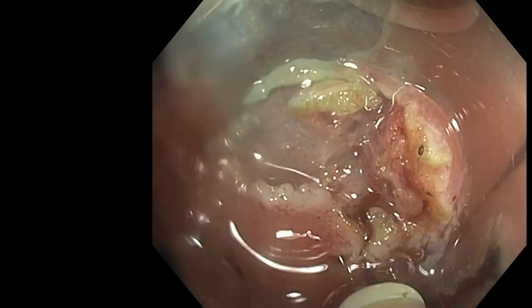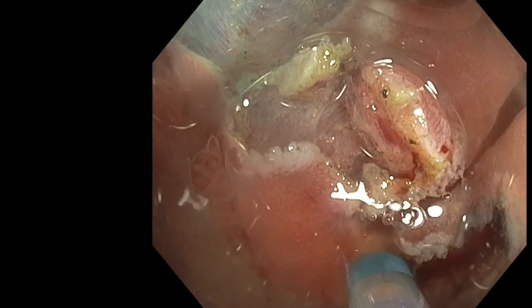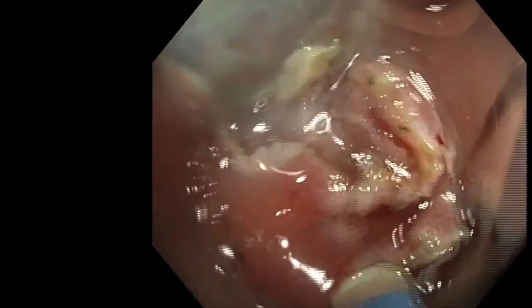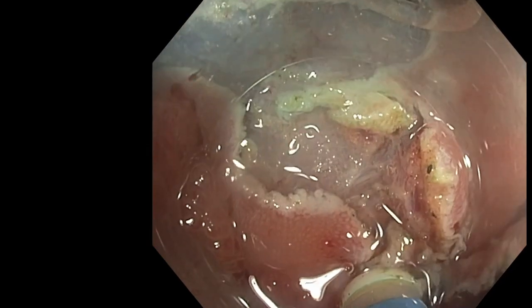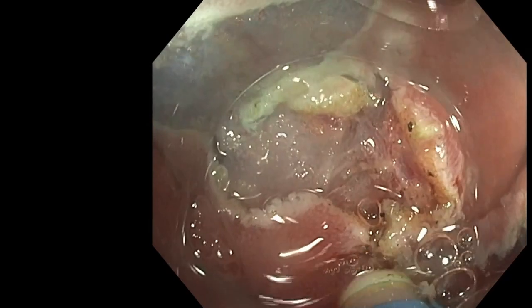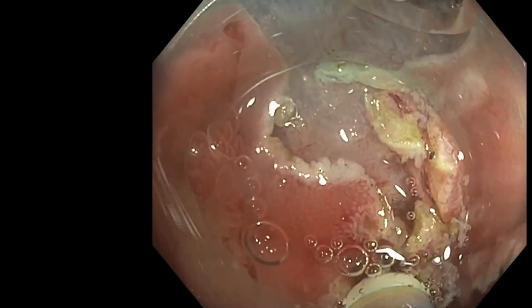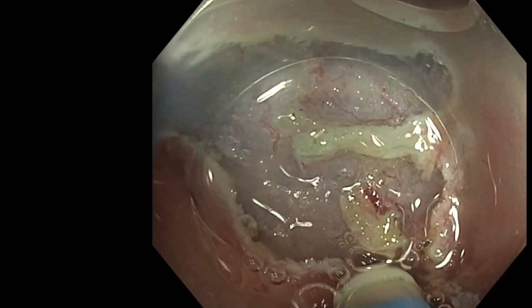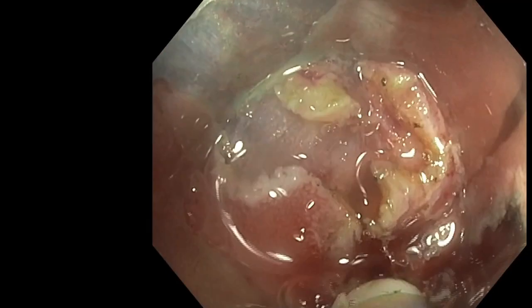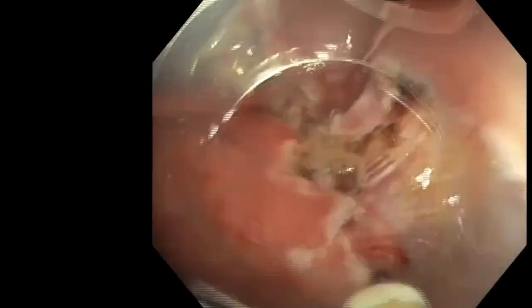I use the dual knife, like we could probably use the hook knife, by pulling back my needle and trying with the ball of the electrode to have this kind of hooking effect in order to pull back the mucosa and have a cutting without deep contact on the muscle. Finally, we could have this complete section, even if it's not perfect and not very good. But at the end, thanks to traction, it will be easier to achieve the resection.